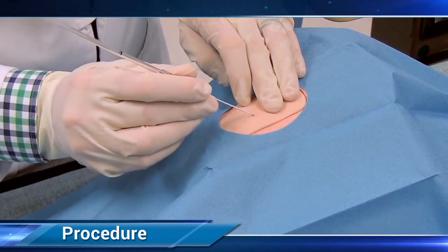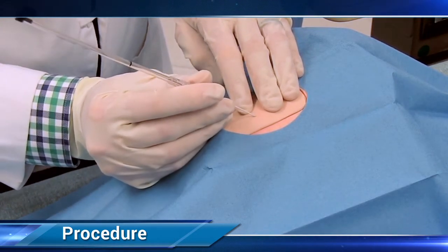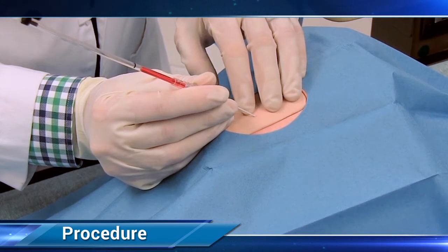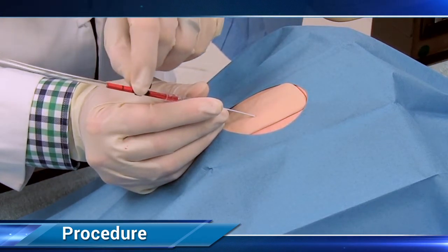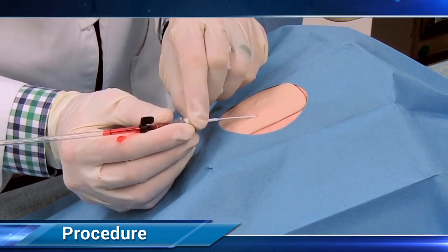The needle should enter the skin at approximately a 30 to 45 degree angle, directly over the point at which the pulse is palpated. Once a flash of blood is obtained, it should be bright red and seen in the hub of the catheter. The needle should then be advanced another 2 to 3 millimeters so the bevel fully enters the vessel. Advance the wire and drop the angle of the catheter 10 to 15 degrees to make it easier to advance the catheter into the vessel.